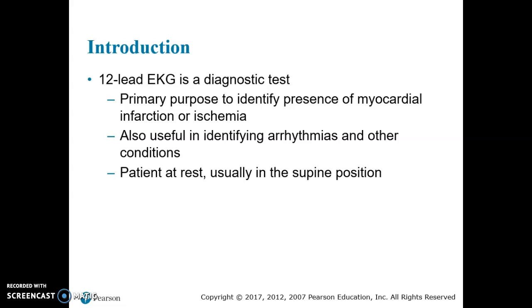identify the presence of a myocardial infarction or an MI or ischemia. And remember, this word ischemia means loss of oxygen. That tissue is dying. It's not getting oxygen. It's losing oxygen. It's also useful in identifying arrhythmias and other conditions like electrolyte imbalances or drug toxicities.